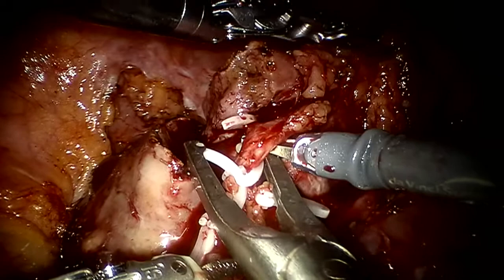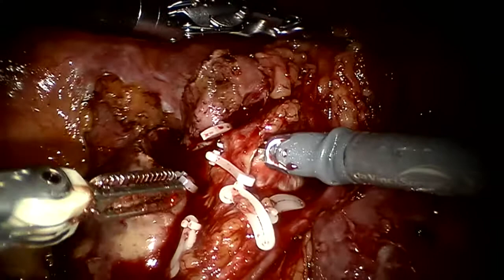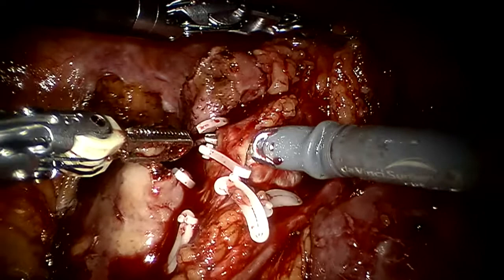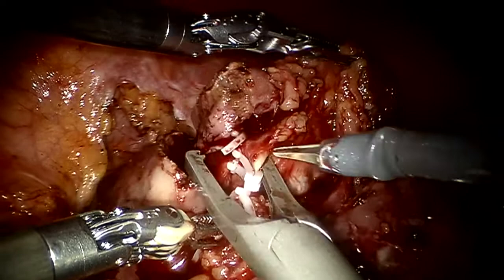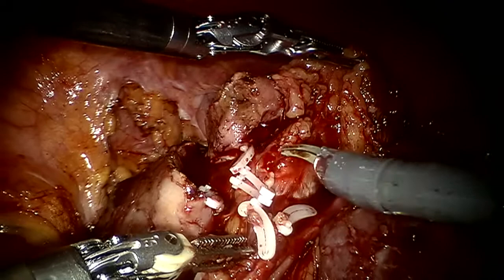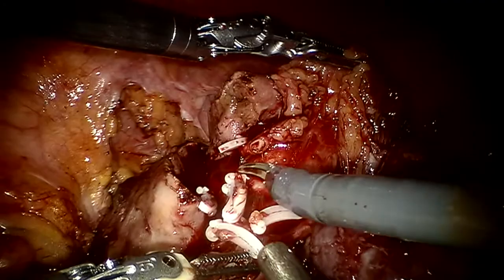One more, please. That's why we took just that branch and just that branch initially, to be 100% sure that now this artery is supplying this part of the kidney and the tumor and has to go. Good. Excellent. Very nicely done, Raid. So it breaks my heart to take that artery, but that's the way God built this tumor.